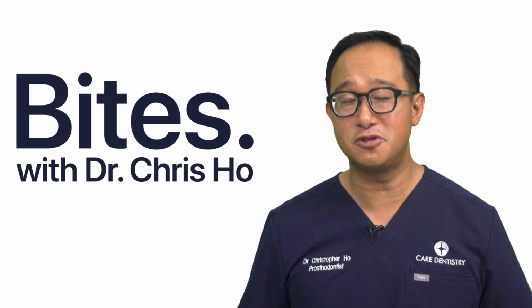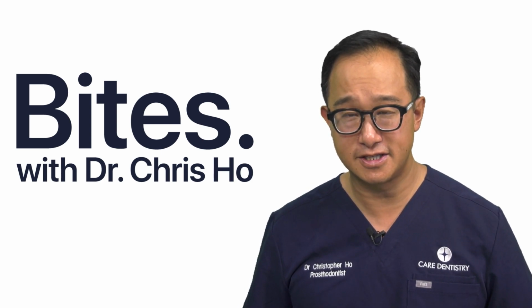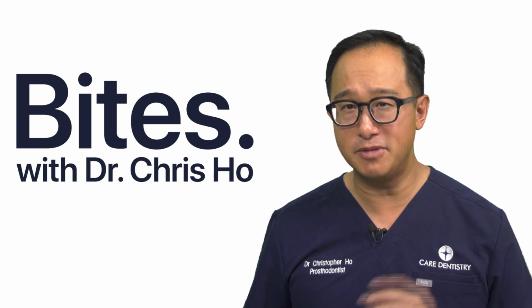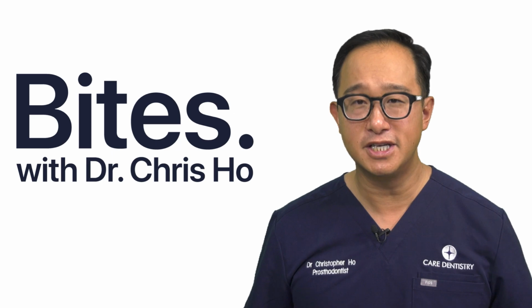So there's so many surgical techniques to try and give you the best soft tissue result for our patients. But sometimes tweaking the abutment design by changing the contours, it just provides you another tool in your toolbox.